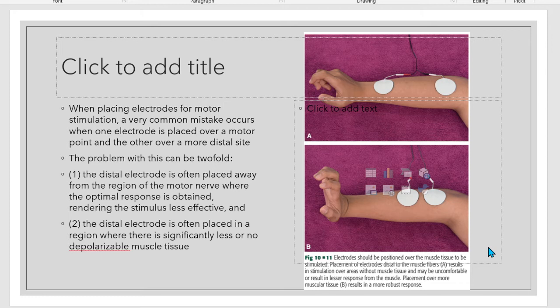So instead of putting it here, which in this area is more tendinous in the extensor group, it's better to put it somewhere here, on the dorsum, because there are small muscles there. But if not, then just place it closer. Just like this one.